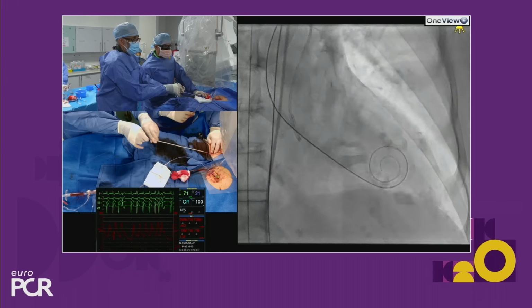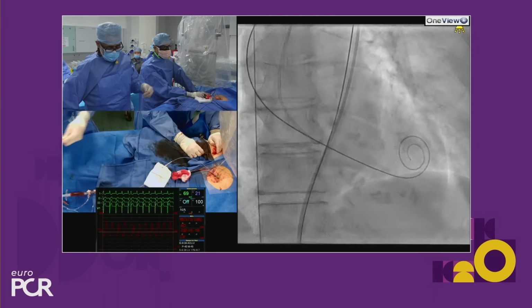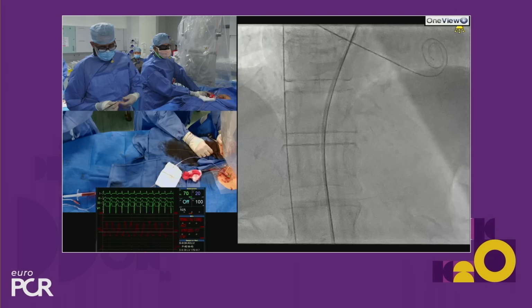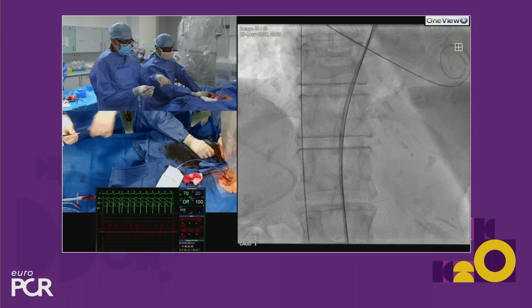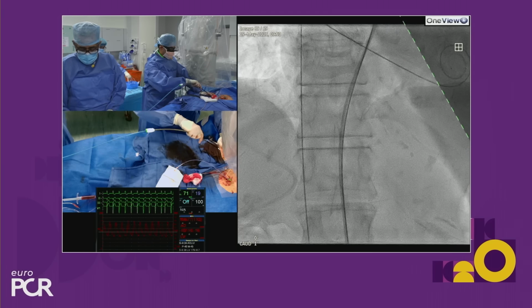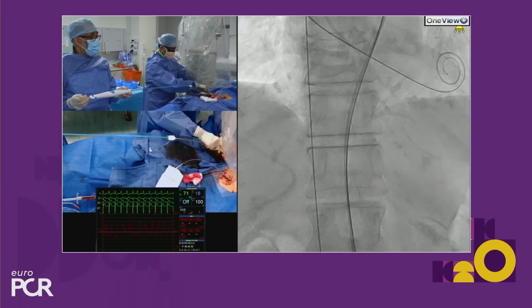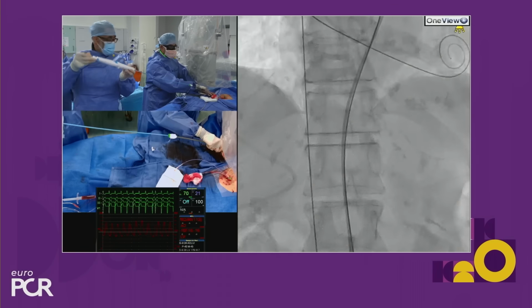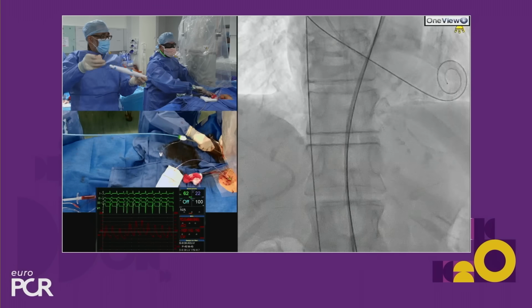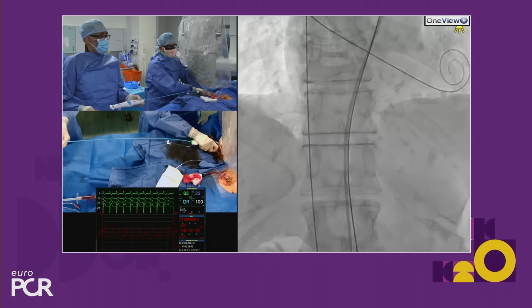So let's go straight PA, please. We'll take a wet and we'll wipe the wire. And just Safari at the top of the screen, please. That's good, thank you. Okay, so we are going to just have the port at 3 o'clock, and I'm holding the wire and just jiggling a bit. Again, let's change the height so that it's vertically downwards, and that should go through the skin. That's it. So I just felt it go through. So the angle's quite important, and now I'm going to get some negative pressure on it as the valve goes up.